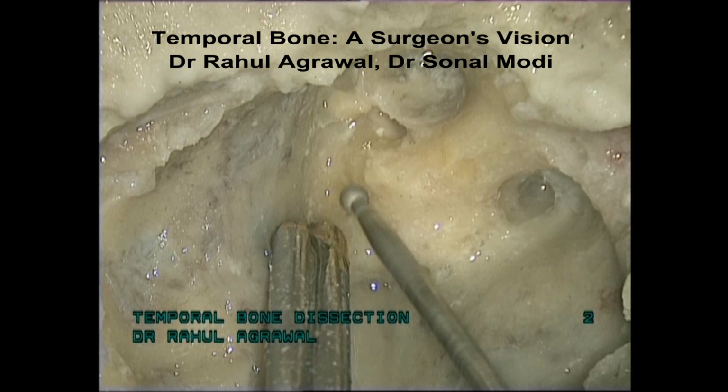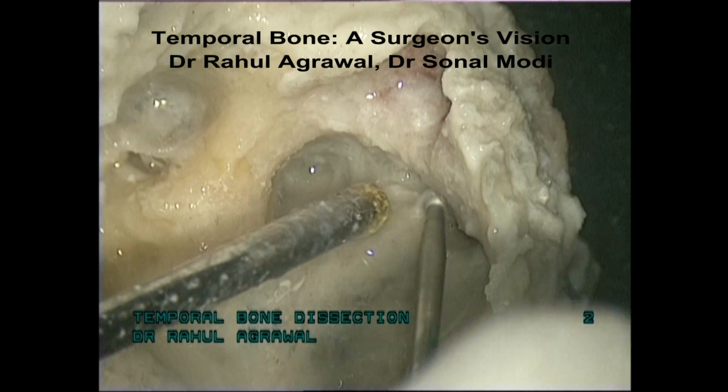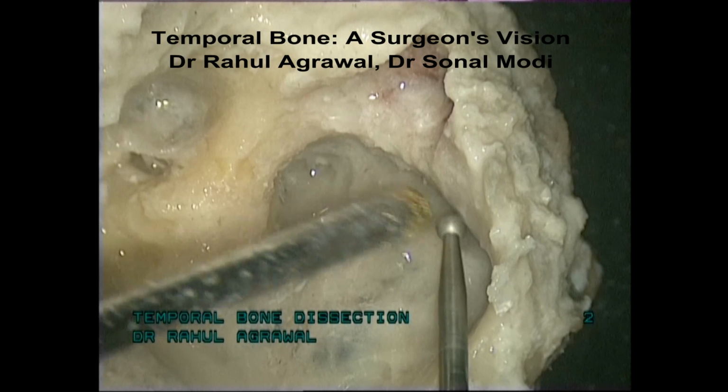Whenever in drilling you have doubt, stop the drilling, go under higher magnification and visualize the structures. Orient yourself anatomically. Here we are drilling the medial tip cells.